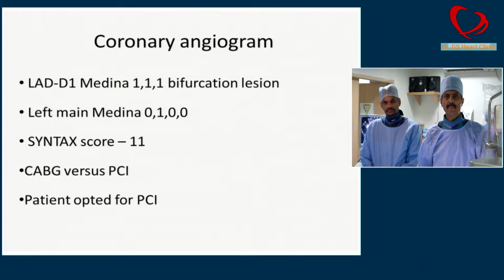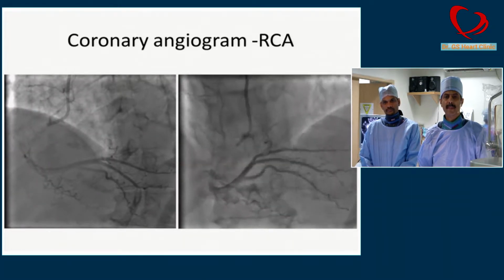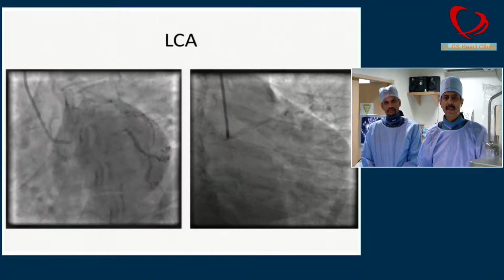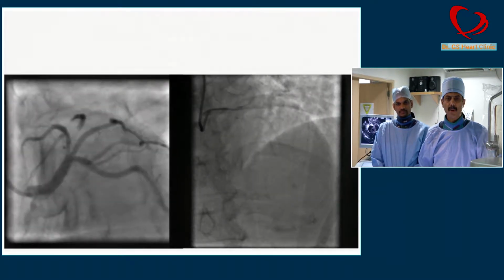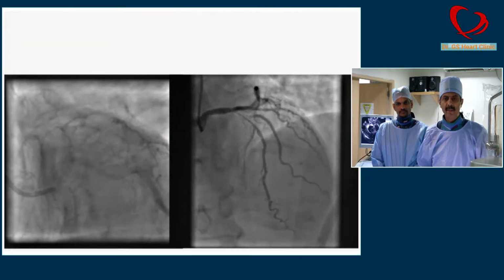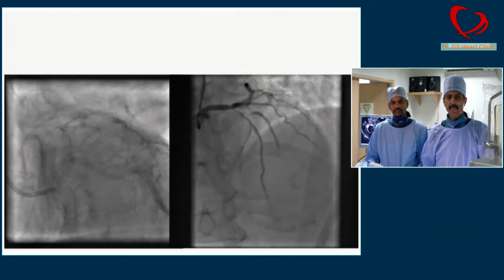Next slide. Can you move to the next slide? Yeah. The right coronary artery is normal. Next slide. So the left coronary artery, the left main is large and there is a trifurcation. There is a disease of the LAD starting from the ostium. The long lesion. It's a very tight lesion from the ostium. I can see the cranial view is a long LAD lesion involving the large diagonal. The diagonal is very large and it has an ostial lesion extending almost 8 mm into the diagonal.